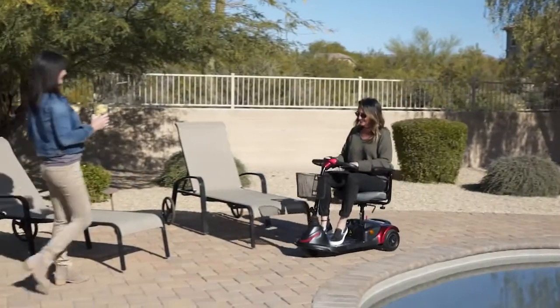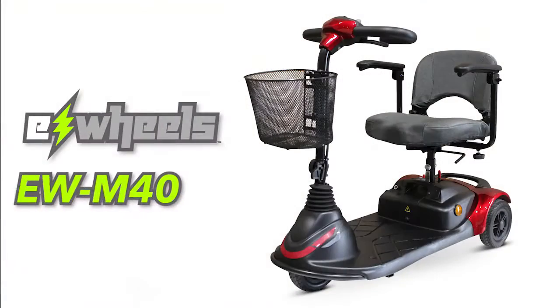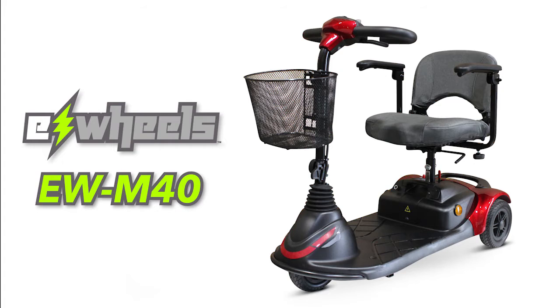So if you're looking for a lightweight, portable scooter with loads of features at a great price, look no further than the EWM40 portable mobility scooter.